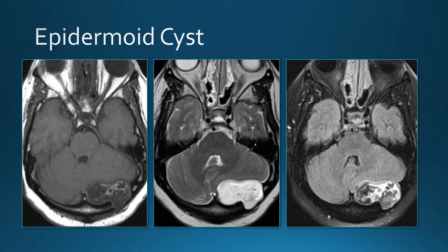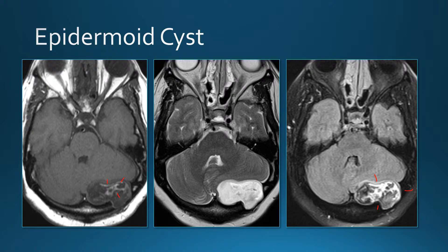This is the same lesion on MR. This one has some bright areas on T1 — most of the time they're dark on T1, but they can have some bright areas. A little bit heterogeneous on T2 and very heterogeneous on FLAIR. The key is the diffusion-weighted images — very bright on diffusion. On ADC they tend to be only iso-intense to brain, but on the regular diffusion-weighted images they're extremely bright.